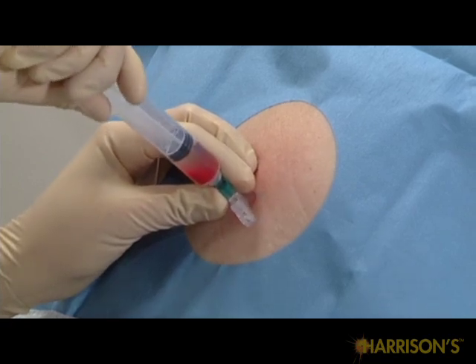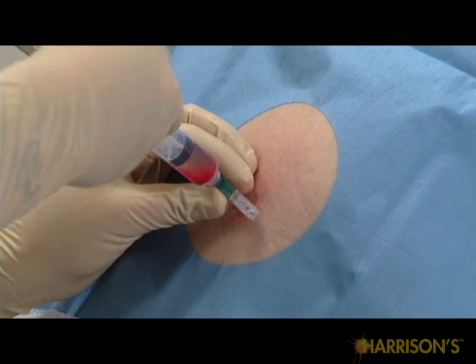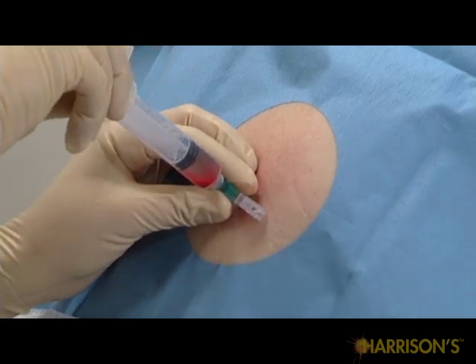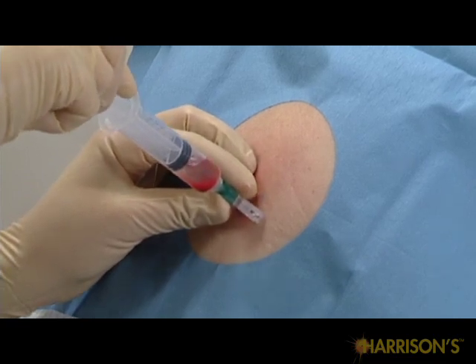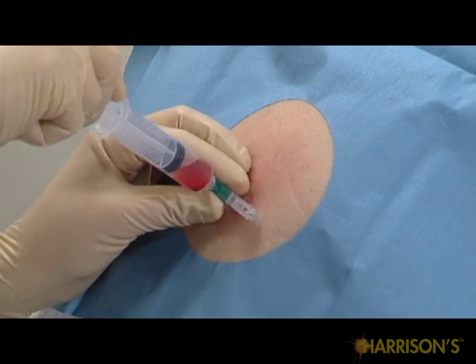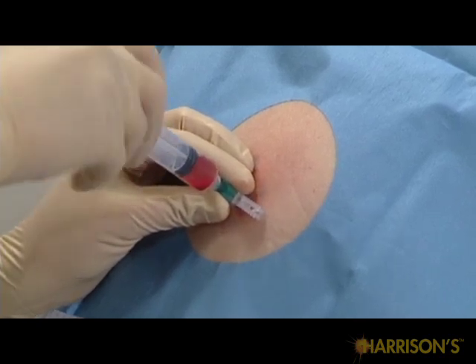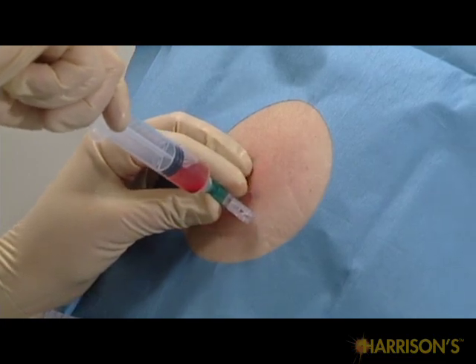Stop and pull back slowly just until the flow stops. This is the pleura itself, and you should place 2 to 3 cc's of 1% lidocaine directly into the space. You can repeat this maneuver to ensure adequate local anesthetic.